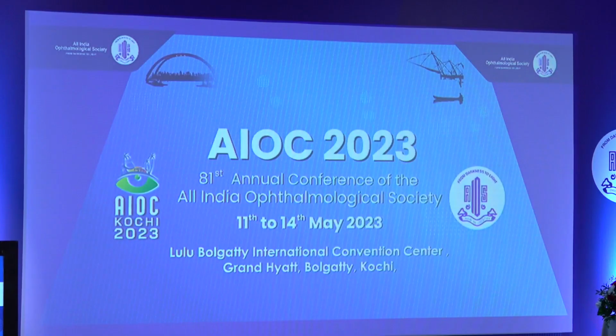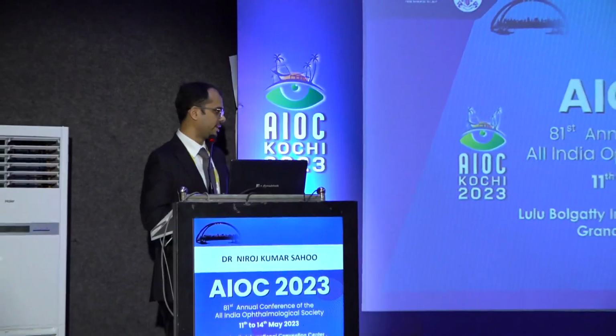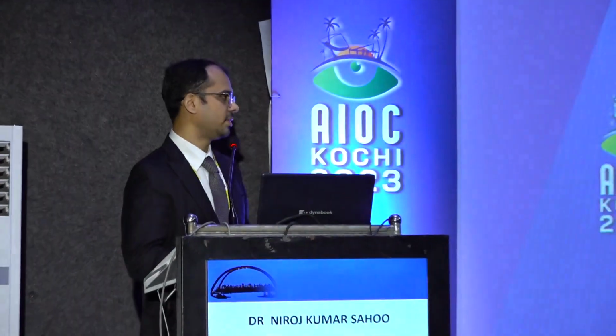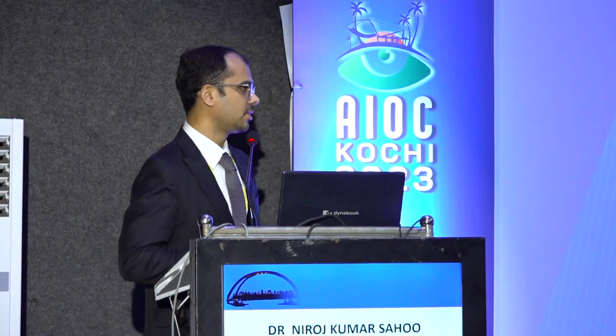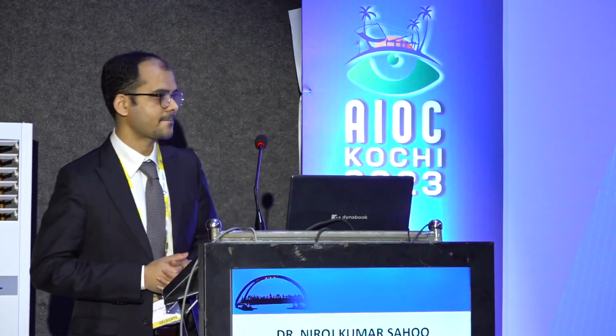Did the amount of ILM peel, the area of ILM peel, affect the closure and the kind of closure? No, the analysis shows that it did not affect it in any way. We measured it postoperatively. That is one limitation. We used the en face OCT again to measure the peeled ILM area, but that was very inaccurate. A better modality would be measuring intraoperative photographs, but that can be done in future studies. Thank you.